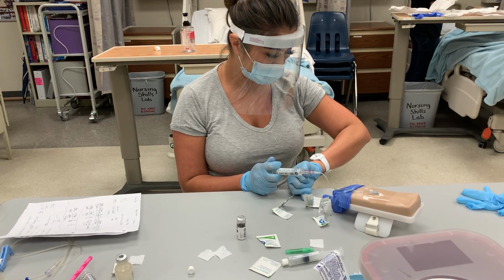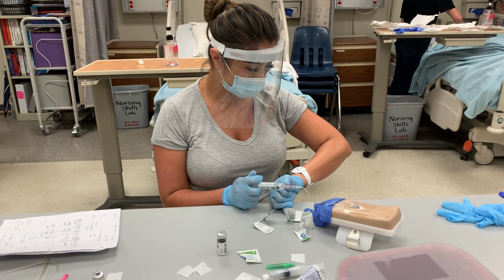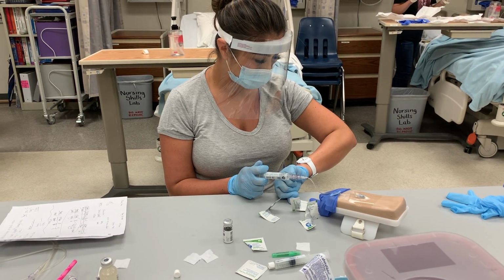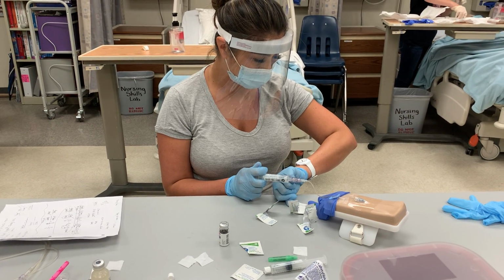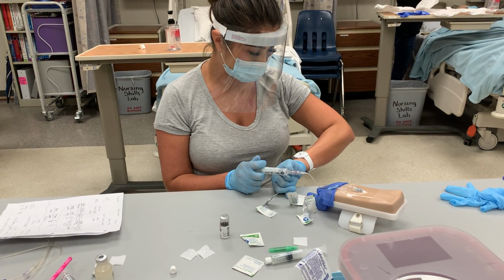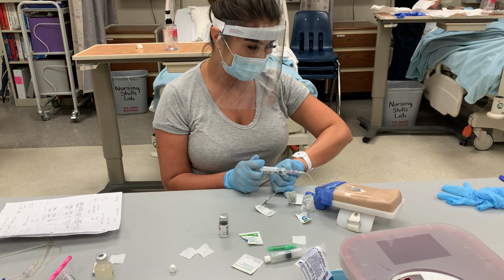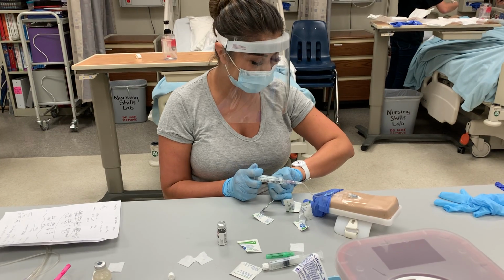For this procedure, I'm going to be laying you flat on your back. If you have any trouble breathing, let me know and I'll take you back. When you're ready, then 3 minutes. Apply the new pad once everything is dry, and just be assessing the site again, making sure everything looks good.